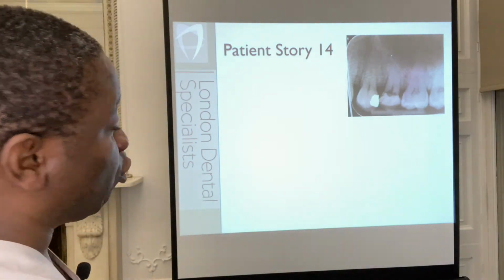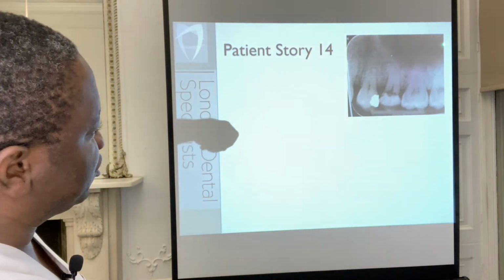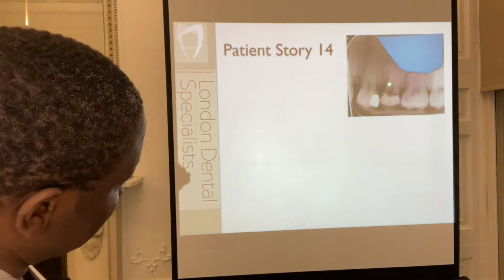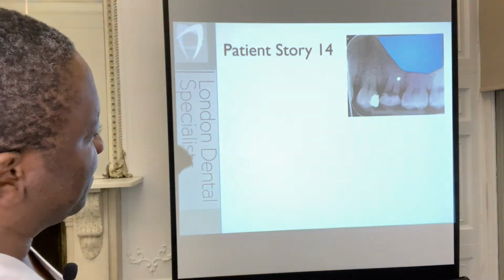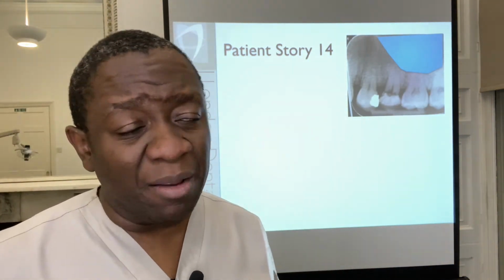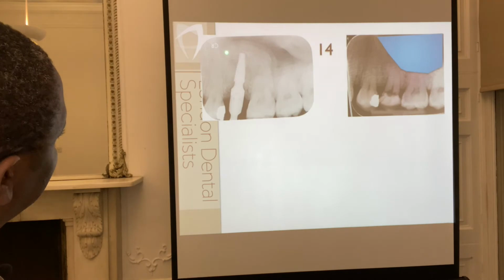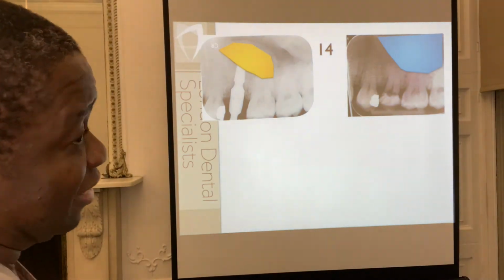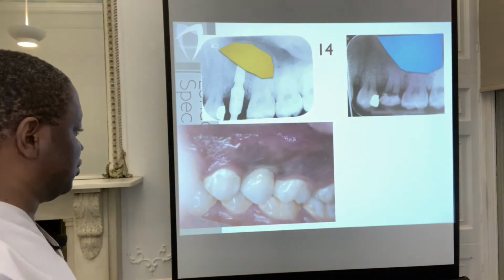So what do we need to do? What do we need to be aware of in respect of the dental implant here? This dark area here is a sinus in the upper left, which I have shaded in blue. And this is the level of bone inside his mouth. Basically, there isn't enough bone height for a dental implant. And so what we did is to place a dental implant, but also at the same time do a bone graft into the sinus, and that's what is shaded here in yellow. That is a very straightforward and relatively predictable procedure to do.